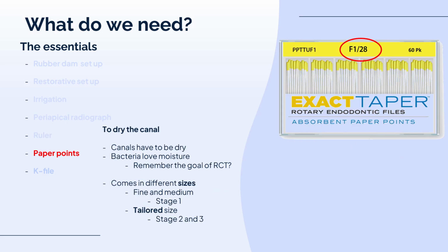Paper points. Okay, after every appointment, we need to dry the tooth. Why? Because bacteria loves moisture. So if you remember, the goal of root canal is to eliminate the bacteria in the tooth. Okay, we don't want to make it an environment for bacteria to replicate. So if you dry the tooth really well, any residual bacteria should die off.